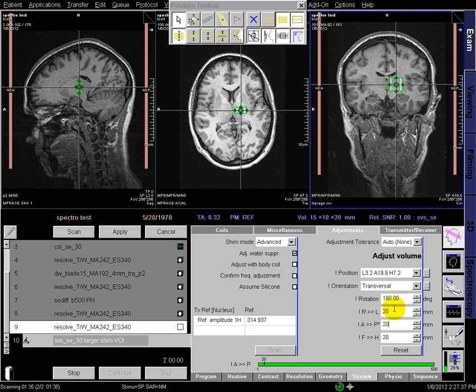Now I typically make this a little bit larger — five millimeters larger than the voxel of interest — because it gives it a better shim around the voxel you're trying to collect data from.